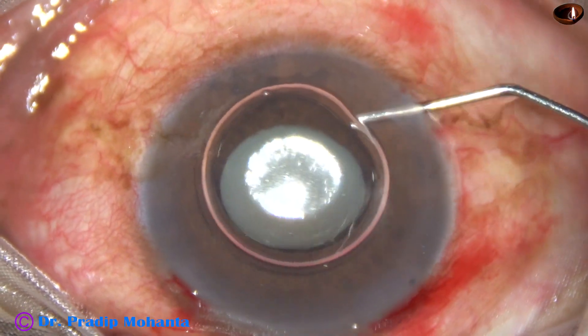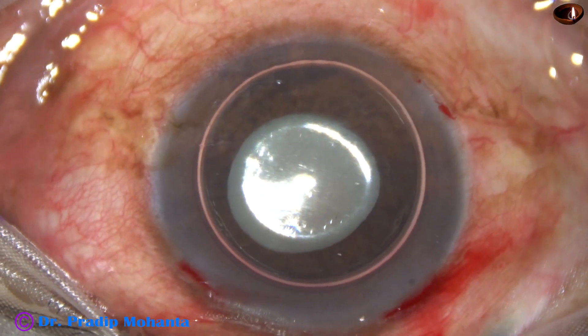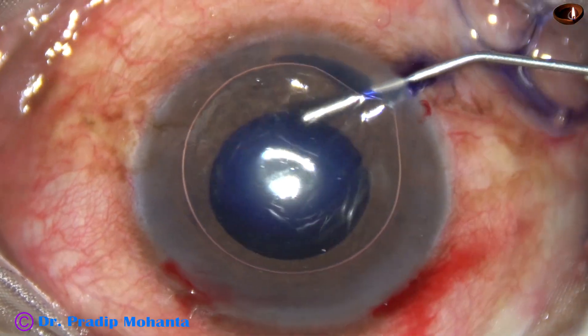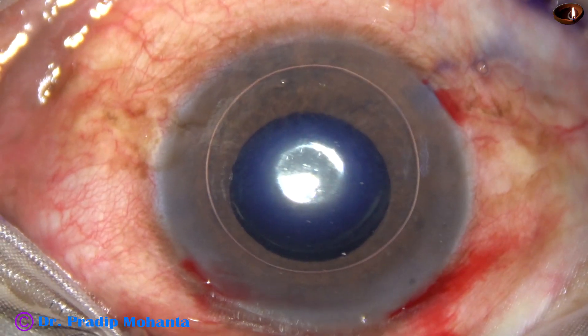An air bubble is injected. Underneath this air bubble, trypan blue 0.06% dye is applied over the anterior capsule.